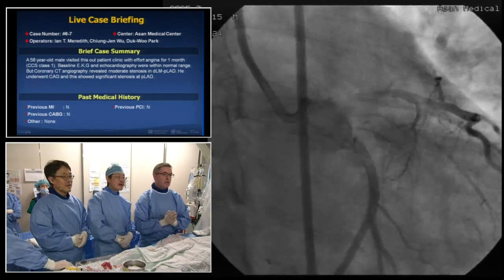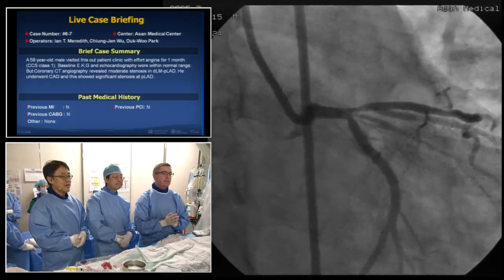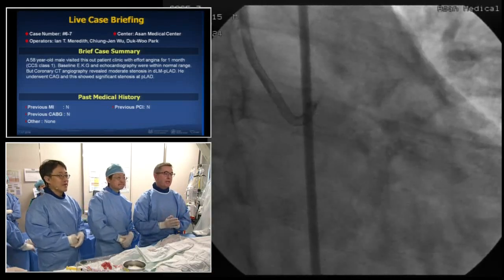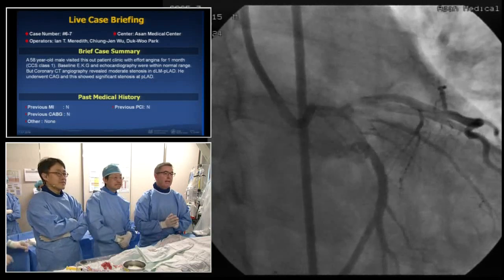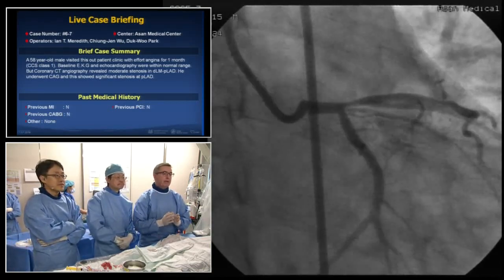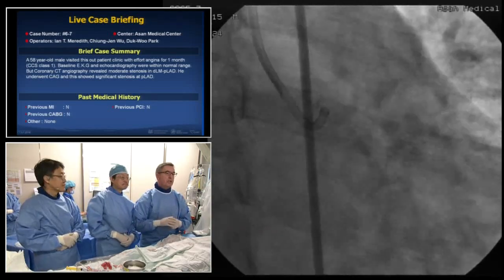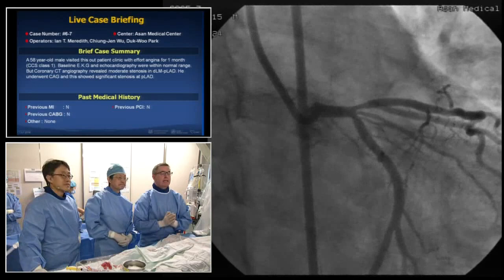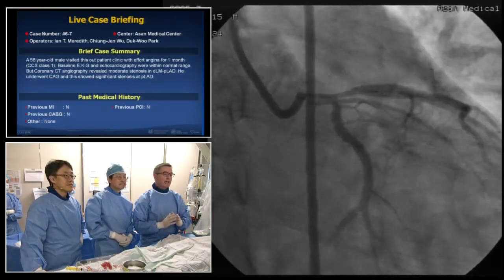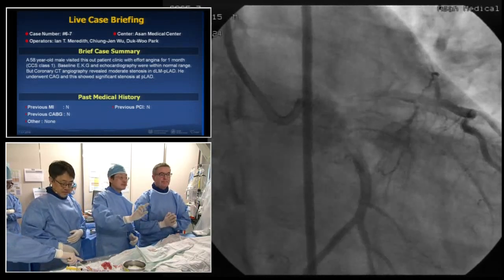You can see that it's a proximal ostial LAD lesion, and on IVUS we'll see shortly it extends back into the left main. Left main's big. Circumflex is a large territory with a large LV supply and has a very healthy origin, and you'll see shortly. Now in the AP caudal view you see there is an obscured diagonal, and in many other views we've looked at, you can only really see the origin of the diagonal into the LAD in an LAO caudal. So we'll show you that.